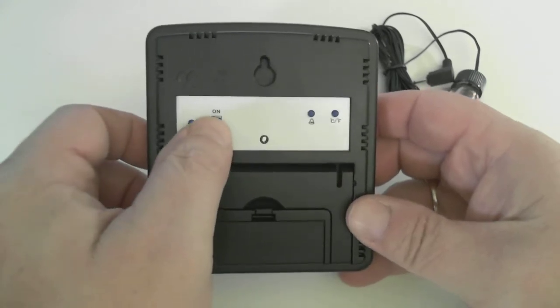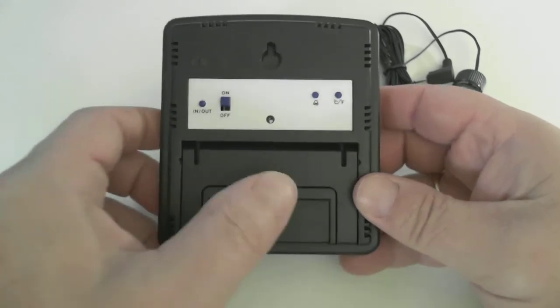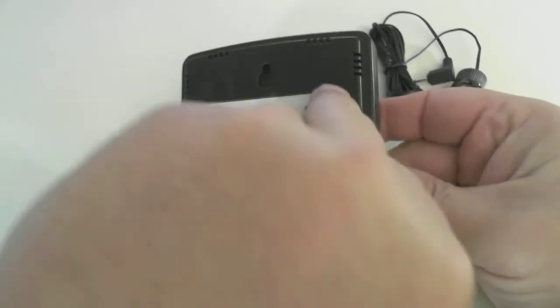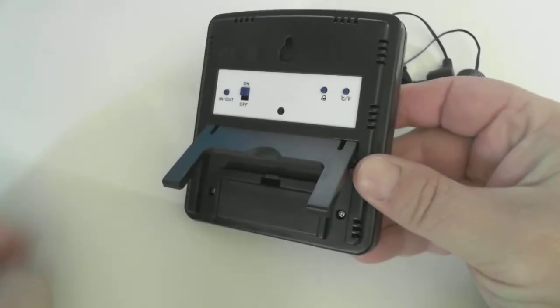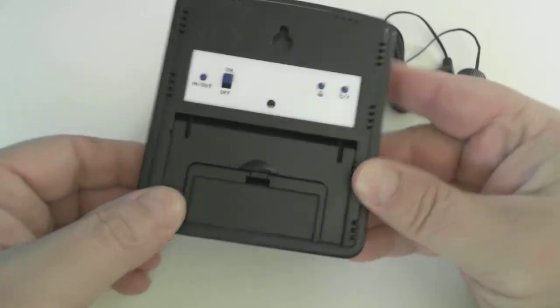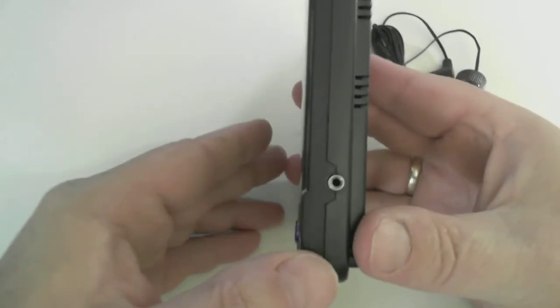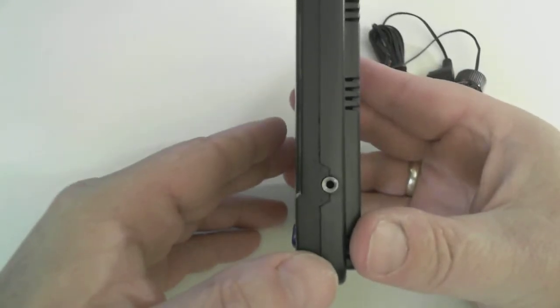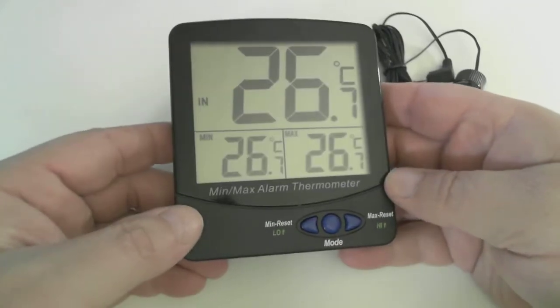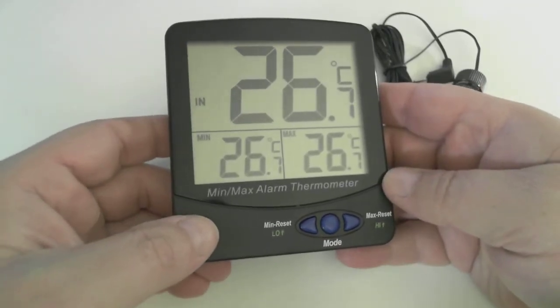Let's turn the unit on. This is your battery compartment. You also have a kick-out table stand. On the side, we have a jack for the external probe. And this is our main display screen.